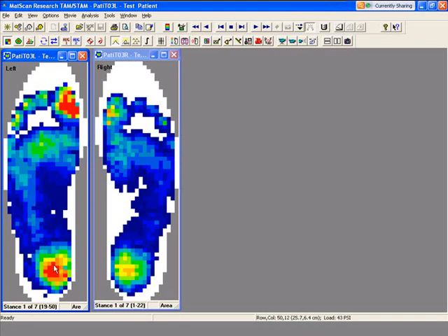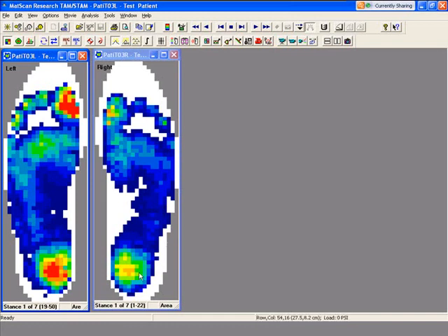When I put my cursor over there, you can see that it's row and column 50 and 12. It tells you the distance, 25.7 centimeters versus 6.4 centimeters, and the load on that cell is 43 psi. You can go to any location, any cell, and get that information. The next view, which is the default view, is the 2D contour.